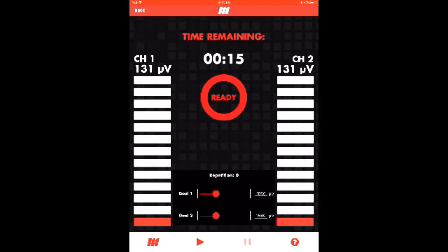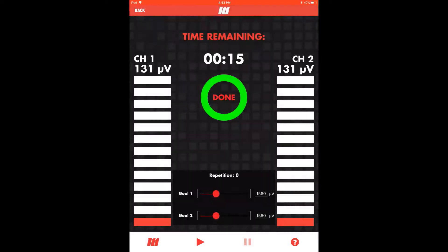In a co-contraction monitoring application, the goal may be to perform an exercise while keeping channel 1, the involved side, active and inhibiting the channel 2 muscle group. For example, the performance of a knee extension with encouragement of quad activation on channel 1 and discouragement of hamstring activation as a compensator. Save session output to view results in the track module.